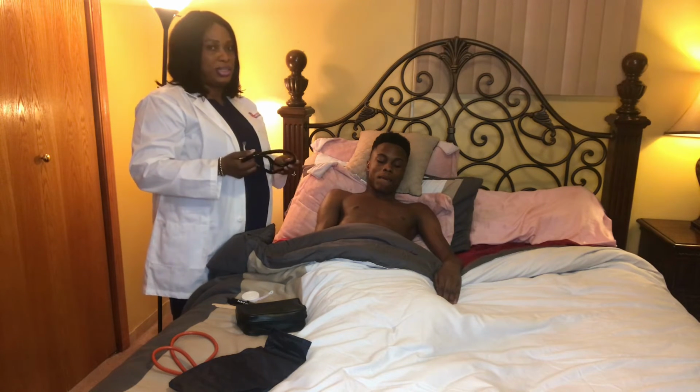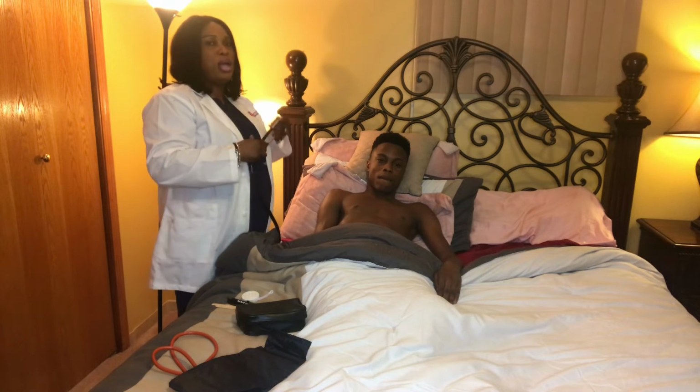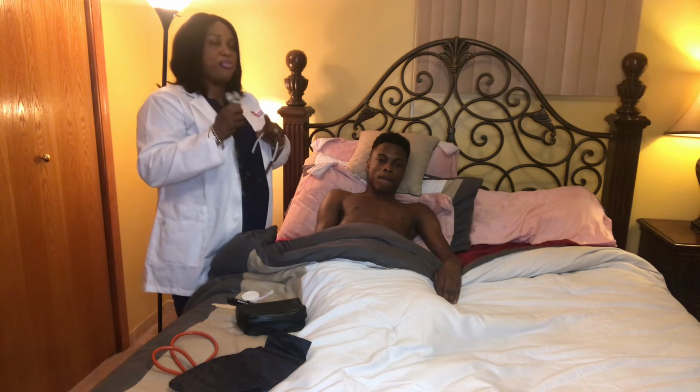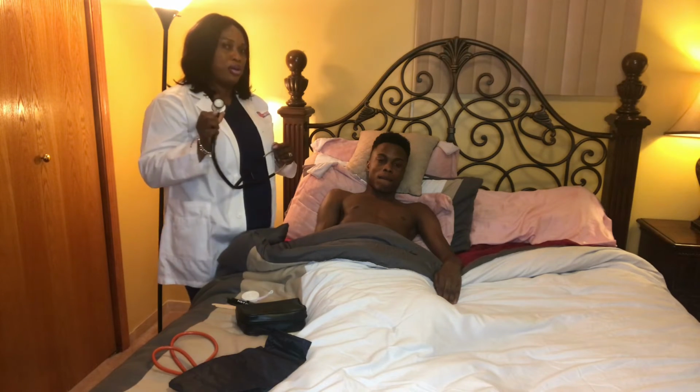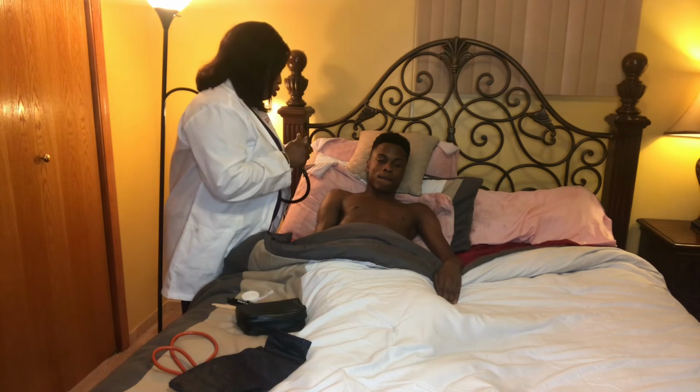to auscultate. I'm going to auscultate my patient's chest wall, and I'm going to be auscultating with my diaphragm, and also I'll be auscultating with the bell of my stethoscope. So now I'm going to be listening to your heart, okay?